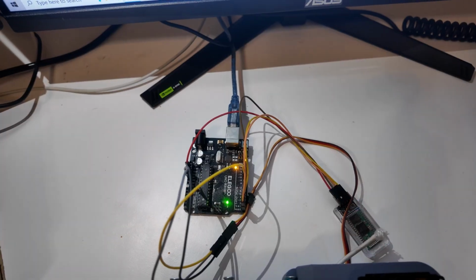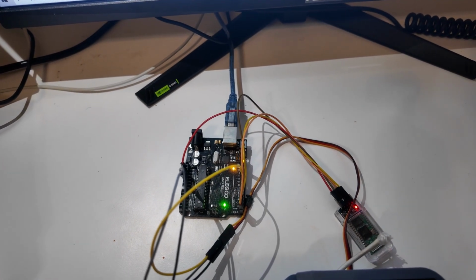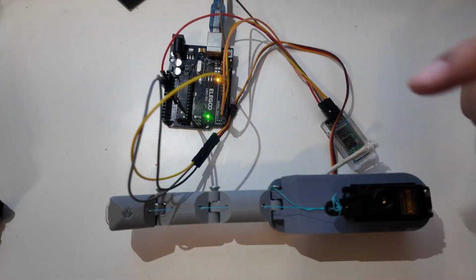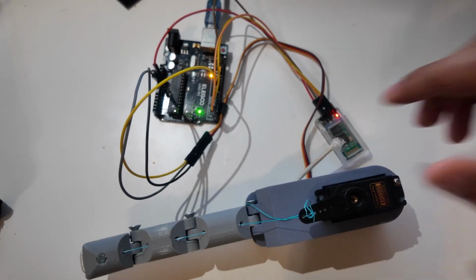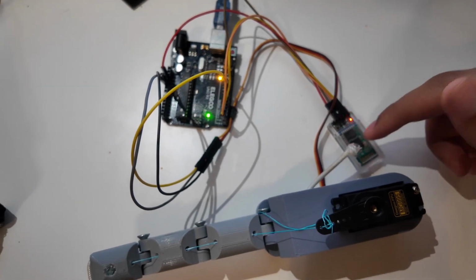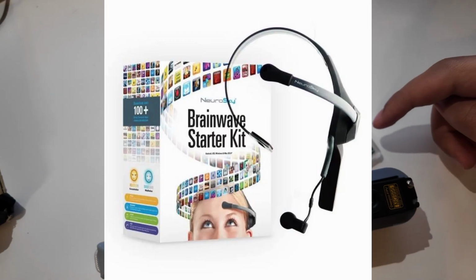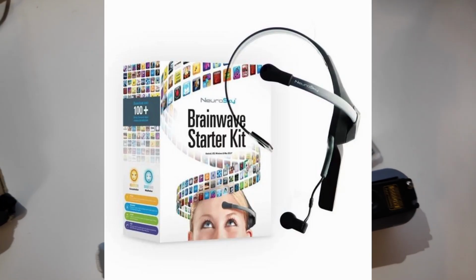Let's go. Before we get into the live demonstration, let me first show how everything is set up. We have an Arduino Uno connected to a Bluetooth module, and that's all connected to our prototype finger. Now, this Bluetooth module will receive data from our EEG headset. The headset I'm going to be using is a NeuroSky Mindwave Mobile 2, simply because it's just the cheapest one I could find, and it's wireless.